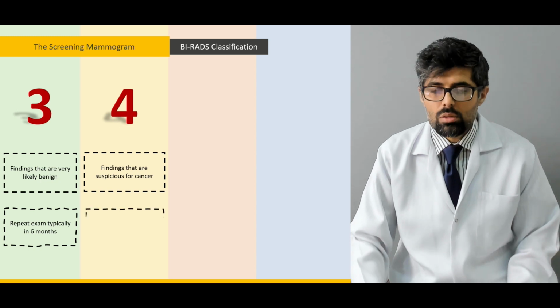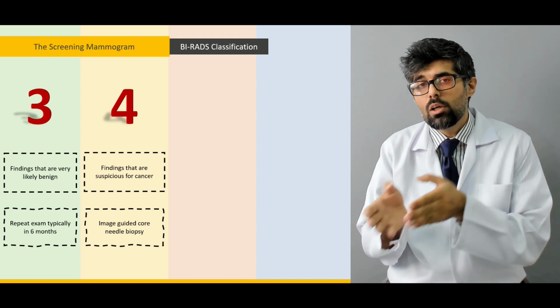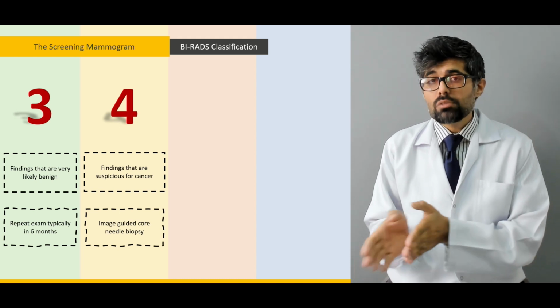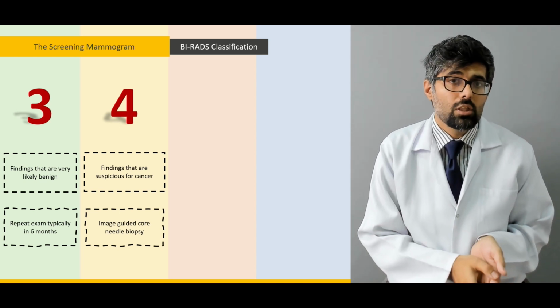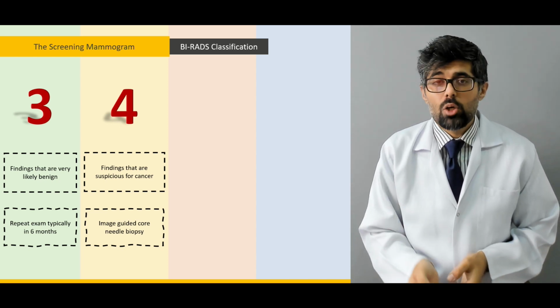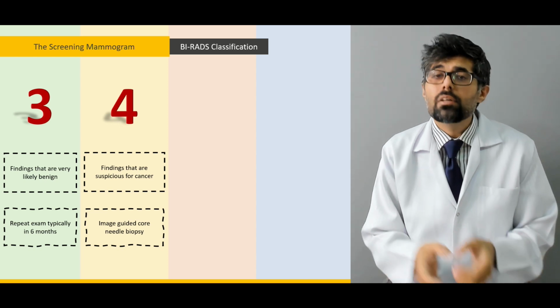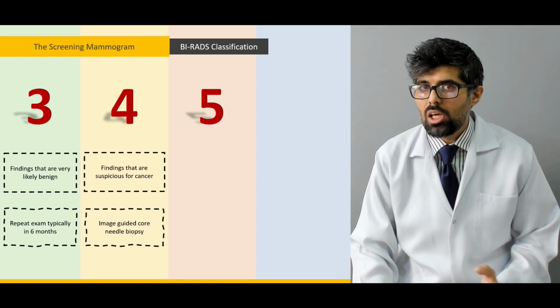So the follow-up advice for such a mammogram patient is that a biopsy must be performed, because now the suspicion for malignancy has reached about 50%. Again, chances must not be taken. A needle biopsy must be performed and a histological exam must be done to find out if it's really malignant or benign.